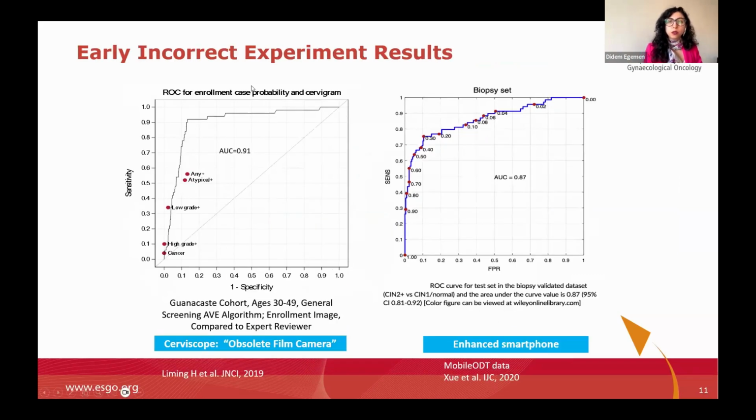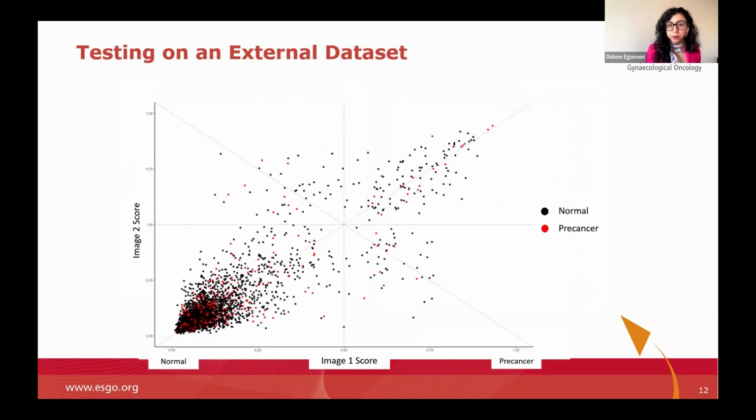Okay, so if you look at these publications, these results are from the internal test sets, and you obtain a very good AUC around 0.9. And in general, when you look at the literature, there are AI applications with 0.9 AUC. These are too-good-to-be-true results. They should be validated on external data to make sure the AI algorithm is applicable to an external environment.